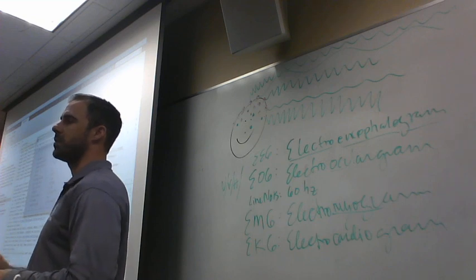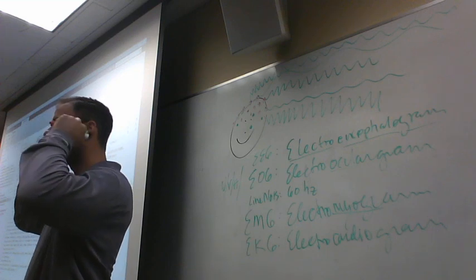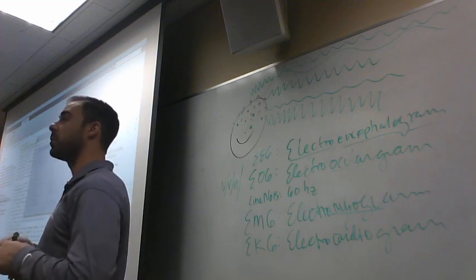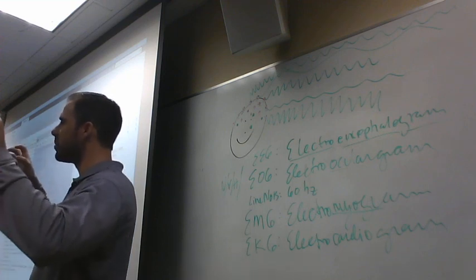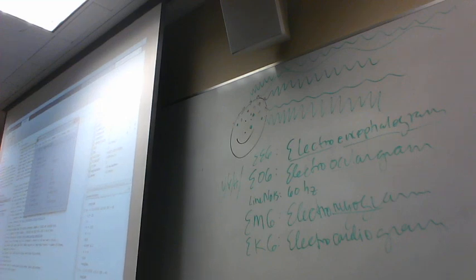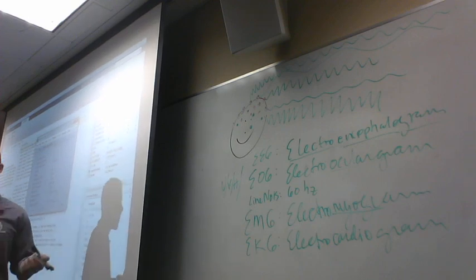When you're blinking, it's actually one of the things you're picking up. Your muscles squeeze and relax, people clench their jaw with all this temporal muscle tension. They yawn, but they try not to blink by scrunching their forehead up. You get all this really tense muscle activity, and that tends to be higher up on this spectrum. Pretty high frequency stuff. So we care about the brain. We don't really care about the muscles. So we'll talk about ways that we get rid of that muscle noise.